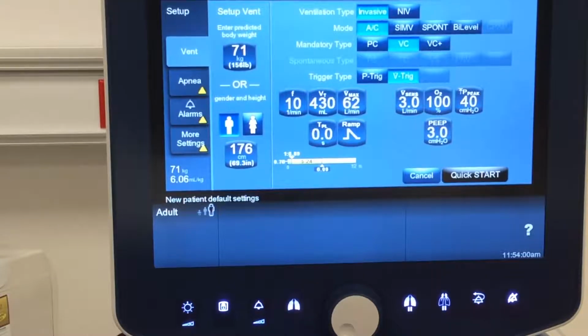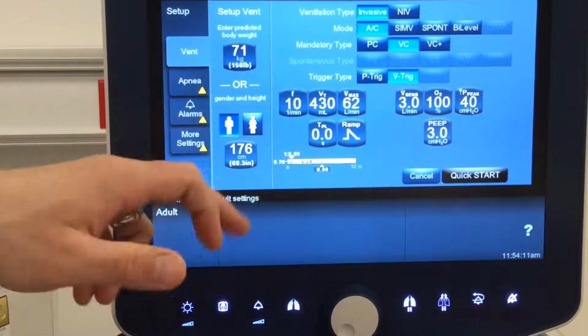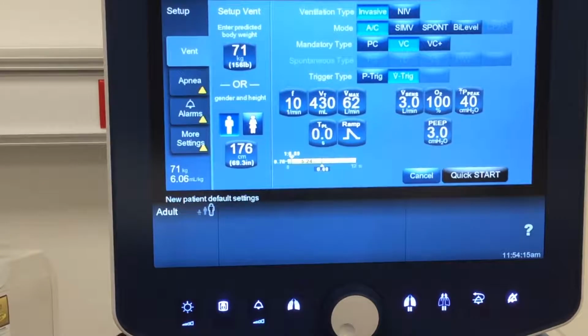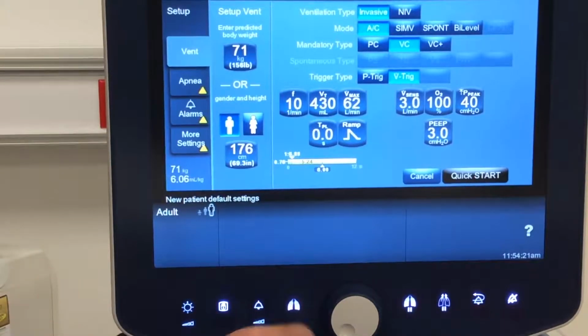So it's important that we think about our patient and what limitations and problems they may have to make sure that we're giving them long enough of a time. All right, even though 1 to 6 sounds like a lot, we might have patients that need a 1 to 10, 1 to 12. Somebody with really, really bad obstructive lung disease, status asthmaticus, COPD exacerbation, something of the sort here. Okay, so let me show you.